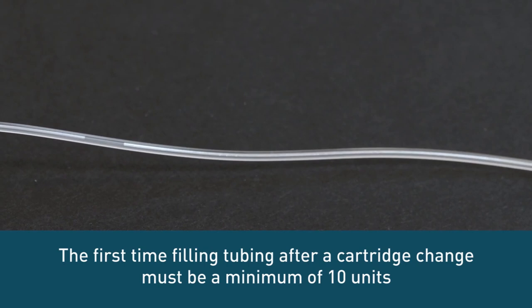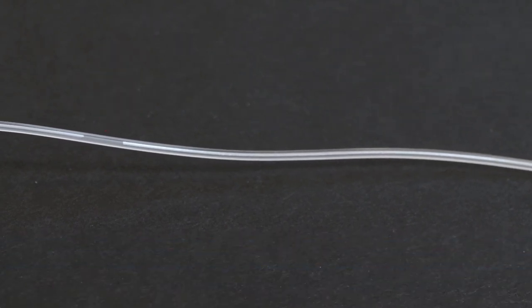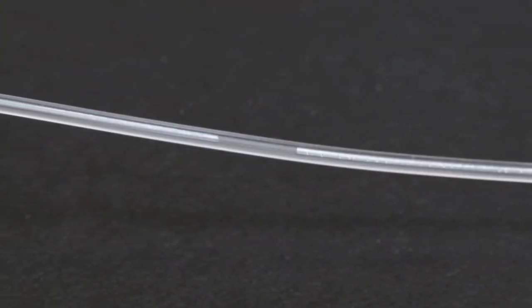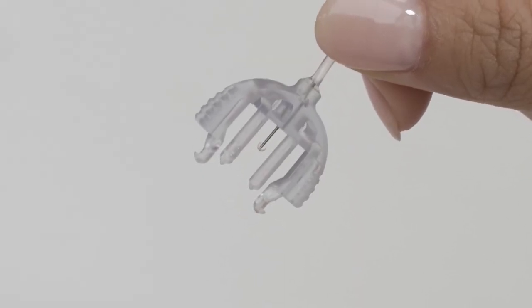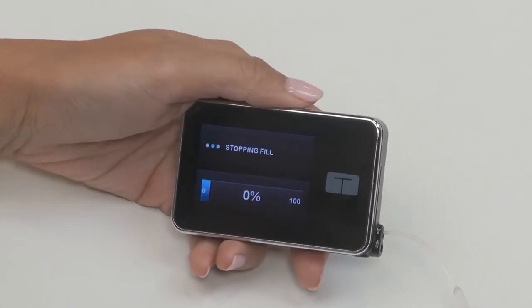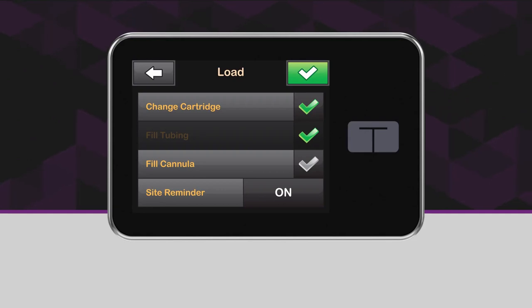Very tiny ones aren't a concern, but anything larger should be pumped out. Even though air bubbles themselves will not harm you, there could be a risk of high blood sugar if air is infused in place of insulin. Once you notice three drops come out of the end of the tubing and you're satisfied that there are no large air bubbles left, tap Stop. Your pump will ask you to confirm that you saw drops at the end of the tubing. If you saw drops, tap Done. If you stop the fill process before you saw drops, tap Fill to continue. You have now successfully filled your tubing.